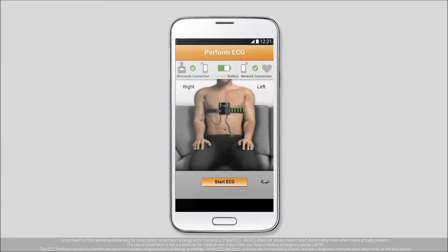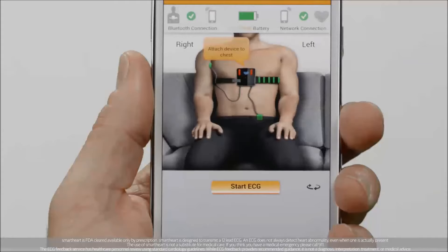If you've placed the device correctly, the electrode positioning screen will show all the electrodes in green, indicating that they're in contact with your body. If an electrode is not in contact, it will be shown in red with an orange instruction bubble next to it.